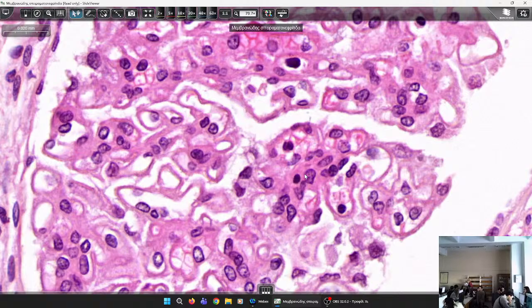Which are they and should be excluded here, both based on immunofluorescence positivity findings and some other things here that I'll tell you. Do you remember the podocytopathies that cause the nephrotic syndrome? They are minimal change disease and focal segmental glomerulosclerosis. However, none of them gives granular immunodepositions in immunofluorescence, so they are excluded.